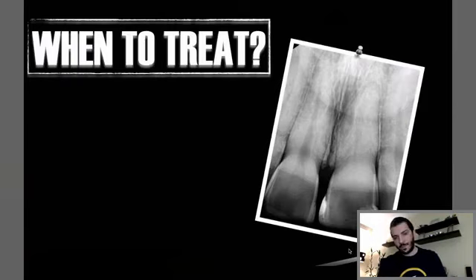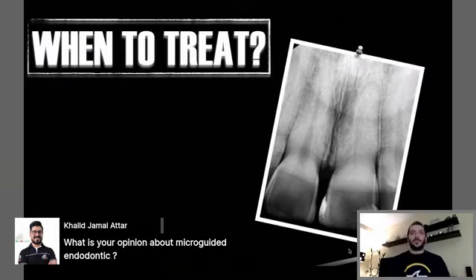Another question, which I think is really interesting, about micro-guided endodontic treatment. When do you suggest to use it? Is it useful for you or not? Any suggestion? Yes, maybe it's useful for severely calcified teeth, but for me it's a little bit time consuming. It's a little bit of a difficult procedure to make the guide and start drilling.